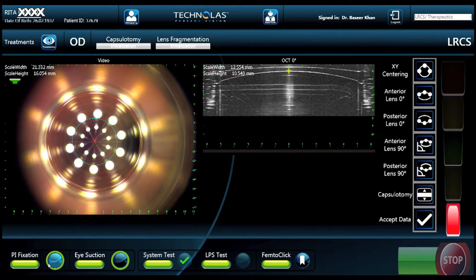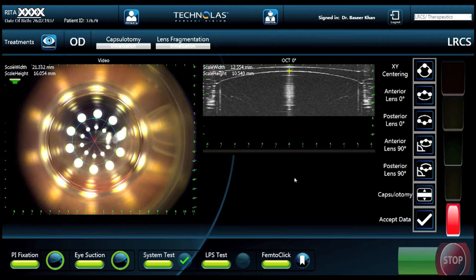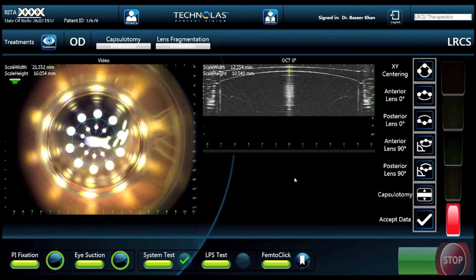We're going to start by looking at the view the surgeon has when using Victus. On the left-hand side, you're going to see an image of the eye as seen through the patient interface. The 10 LED lights are there to project an image onto the cornea to help with centration and docking of the eye with the interface. As the patient moves closer to the interface, the image of the eye becomes more clear.